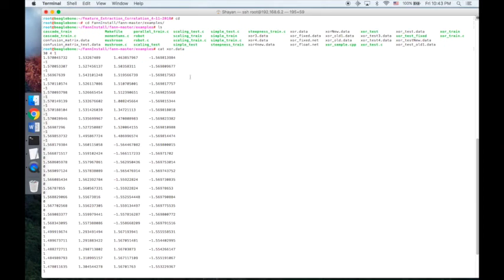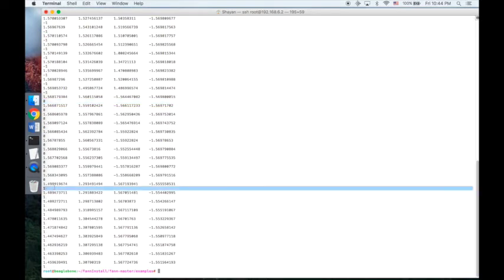Now, this shows the training dataset file, and here we have 30 sets of data, and that is 10 rows for each of the 3 types of motion. We have 4 inputs, which is our 4 features, and 1 output, which is the motion type. -1 corresponds to the motion type of short strides, 0 corresponds to motion type of long strides, and 1 corresponds to motion type of sitting.